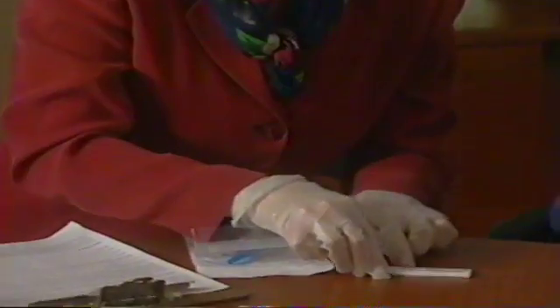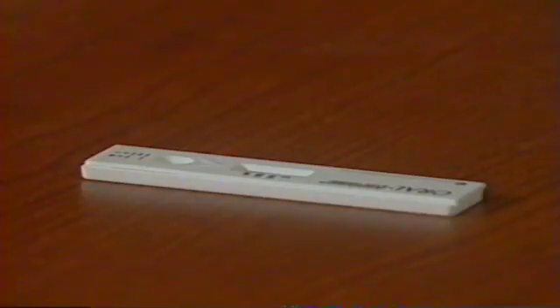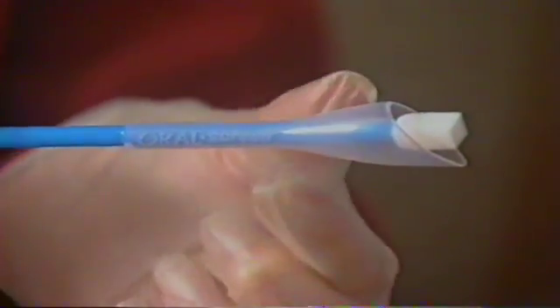Start by removing the test device from the foil pack and placing it on a flat surface. Once removed from the package, verify that there are green lines next to each imprinted drug or control mark. Do not use the device if these lines are not present. Ensure that the person being tested has had nothing in their mouth for at least 5 minutes prior to sample collection. Next, remove the collector from the packaging, then slide the plastic hood back, exposing the AccuSorb foam.